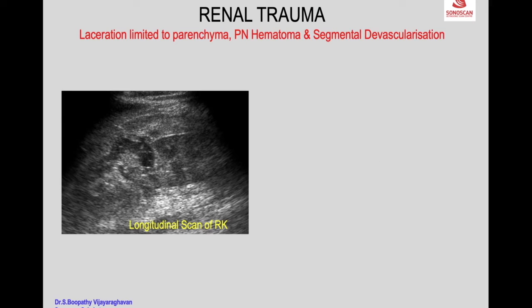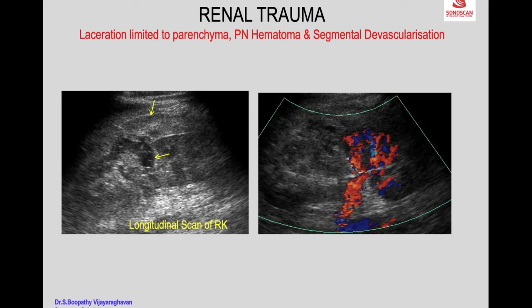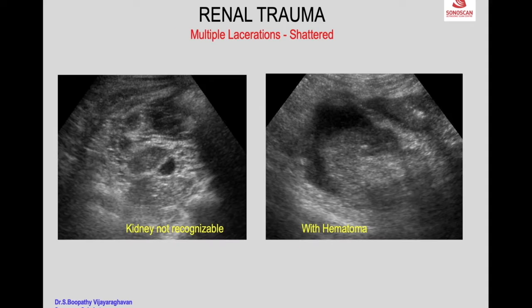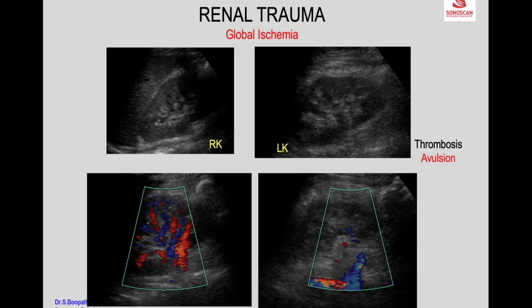Here again you see the laceration and the perinephric hematoma, but when you put on color Doppler you see the upper half of the kidney does not show any flow. This is due to segmental devascularization — a shattered kidney — where you fail to appreciate the renal outline, indicating avulsion or thrombosis of the main renal artery.